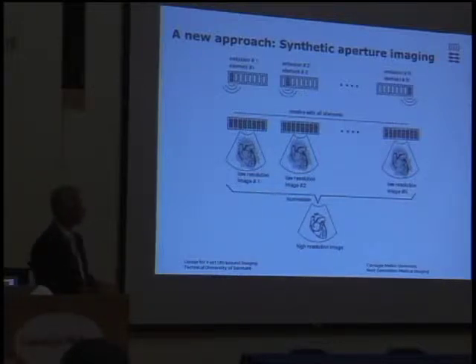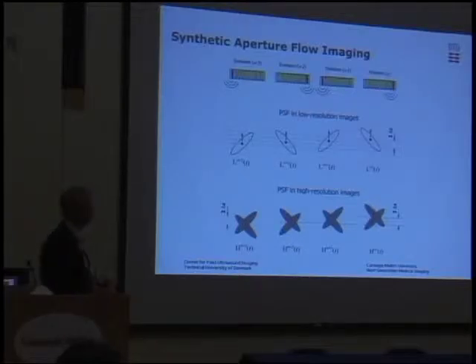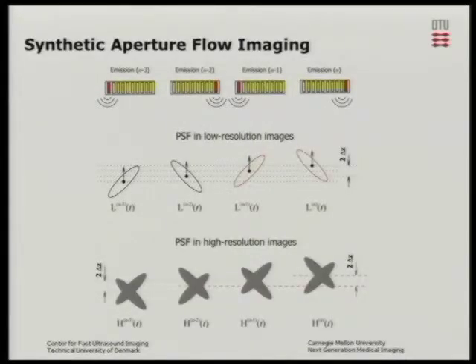And you can actually go in the clinic and compare with normal imaging and see that that actually translates into better images. But what I want to concentrate on today is flow. And of course, it's a somewhat ridiculous idea to spread out your imaging over multiple shots when things are moving. So the question is, can you actually make flow with this?